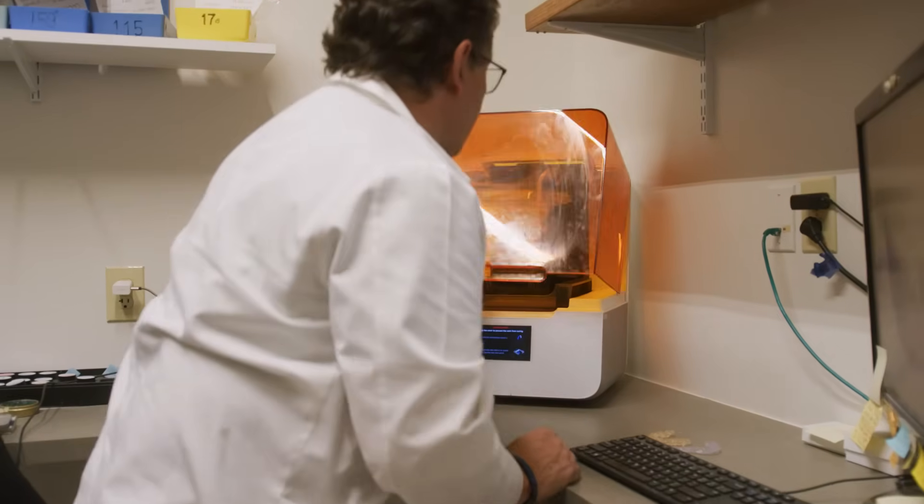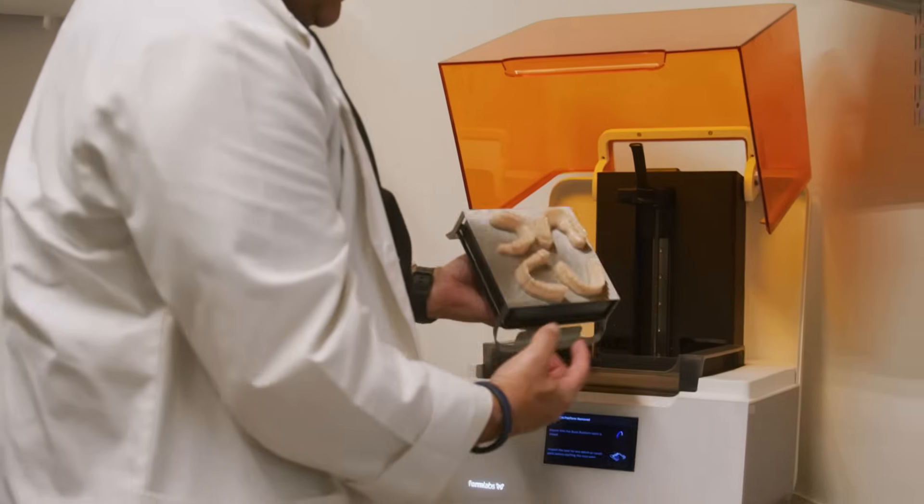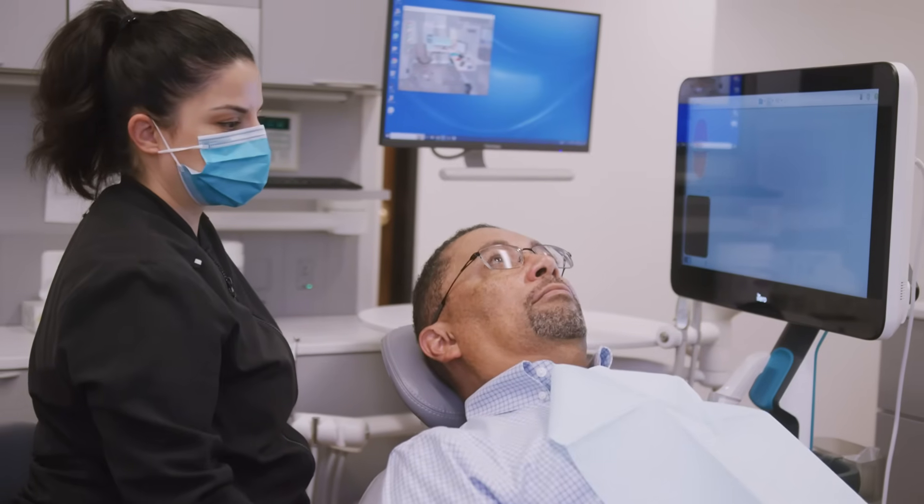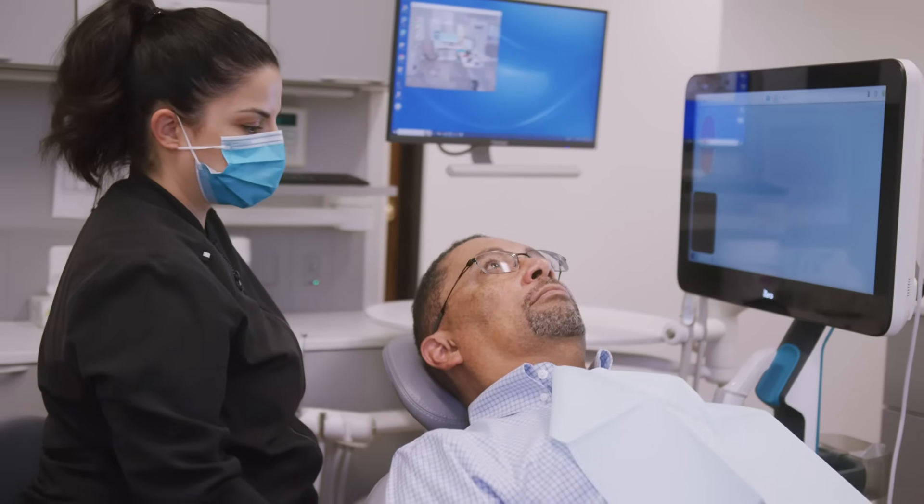Once we've gathered all of that data and input it into our software, your surgeon is the one planning the guided implant process. I'm looking at fabricating a guide that our in-house lab will 3D print and refine, so that on the day of surgery, we're placing your implant through the guide rather than free handing or guessing where the implant needs to go.